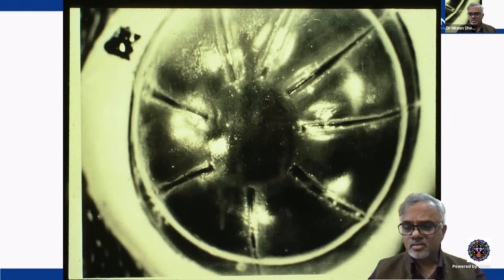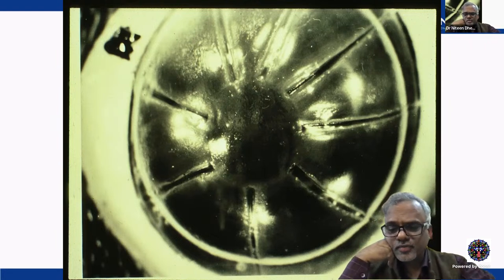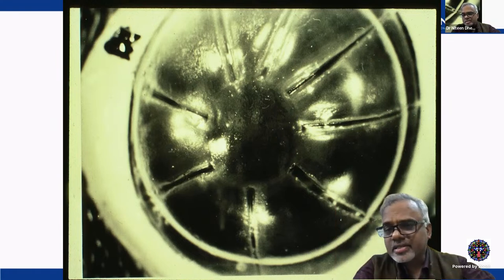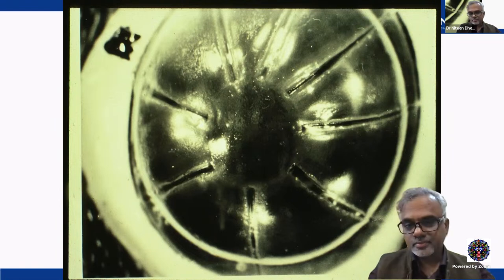So, what is the excimer laser? Is it light, or current, or energy, or sound? It's light-based. Light. So excimer is a light. Yes. So when you fire a light on a transparent tissue like the cornea, what do we expect to happen? If a light falls on the cornea, what is the normal expectation? How should the light behave? A part of it will get reflected, a part of it will pass through, and a part gets absorbed. Okay. So if it is a transparent tissue, most of the light should pass through. Yes. So we expect that laser or light to pass through the cornea. But here, with an excimer laser, that photon, that light, is sitting on the cornea and making a slice, not going inside. What is this?